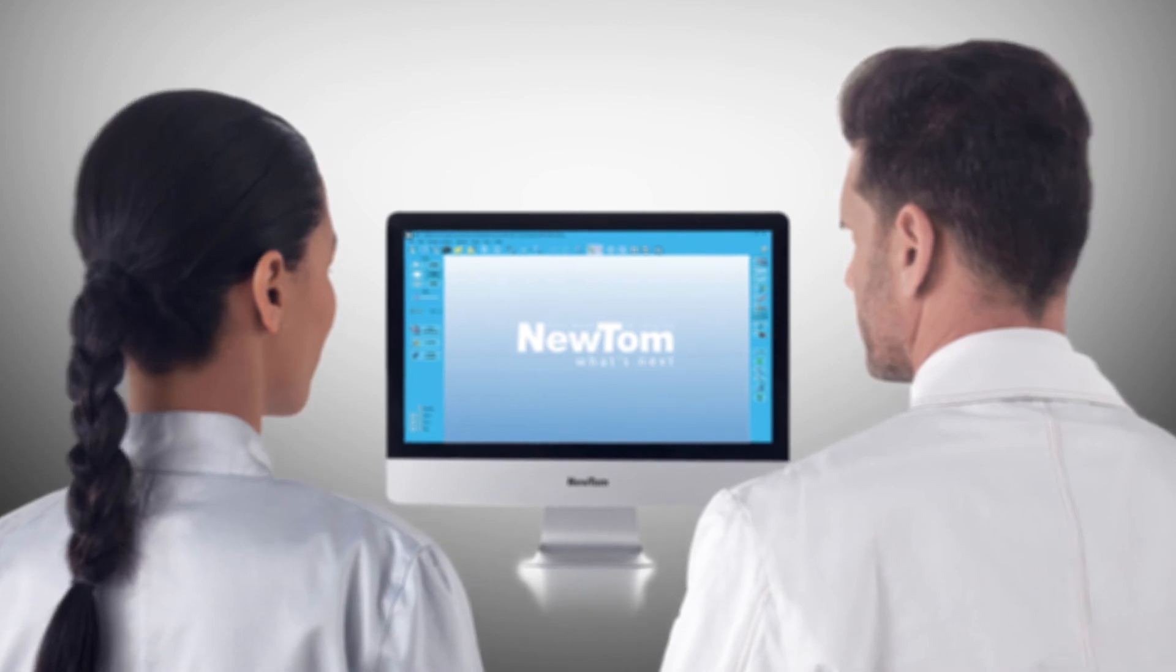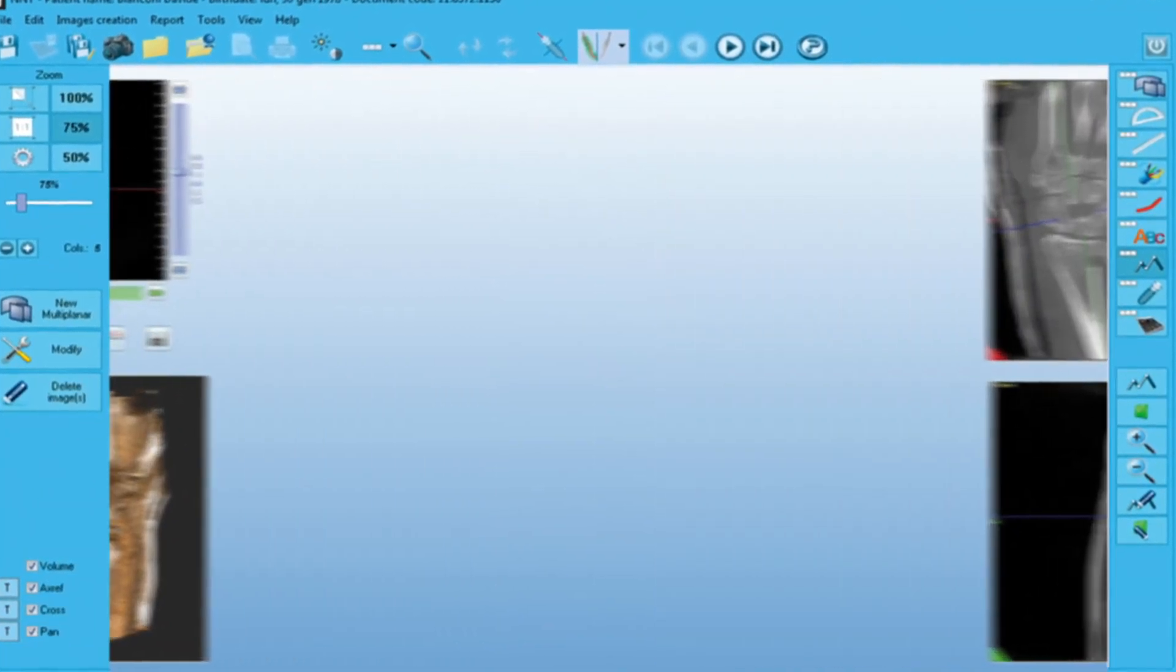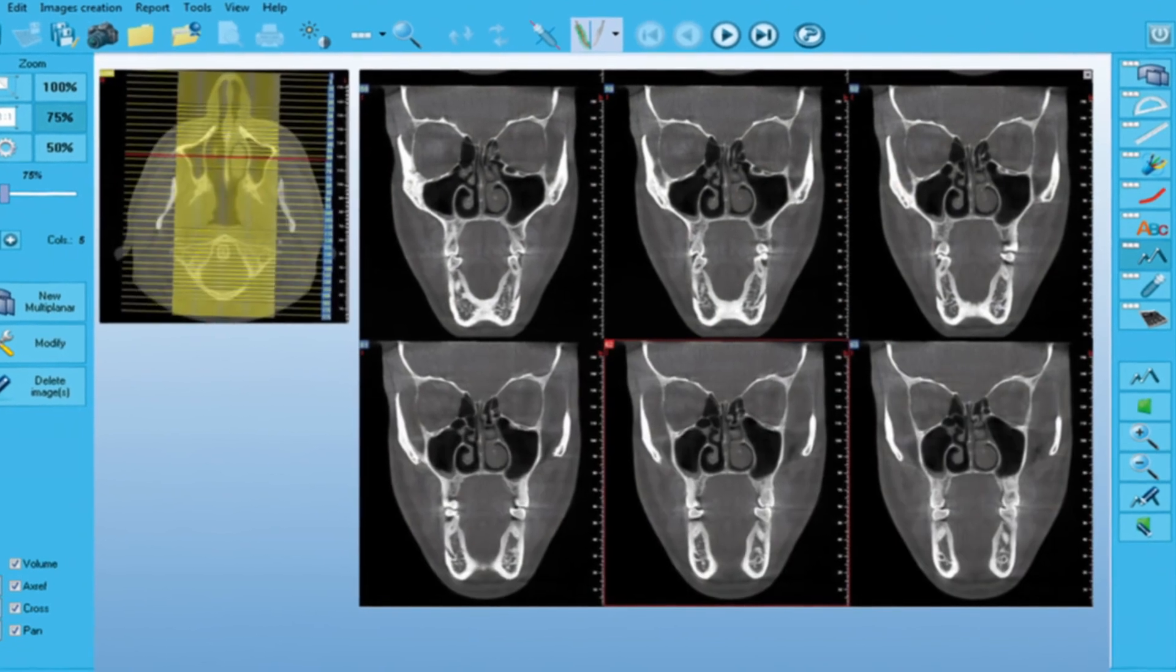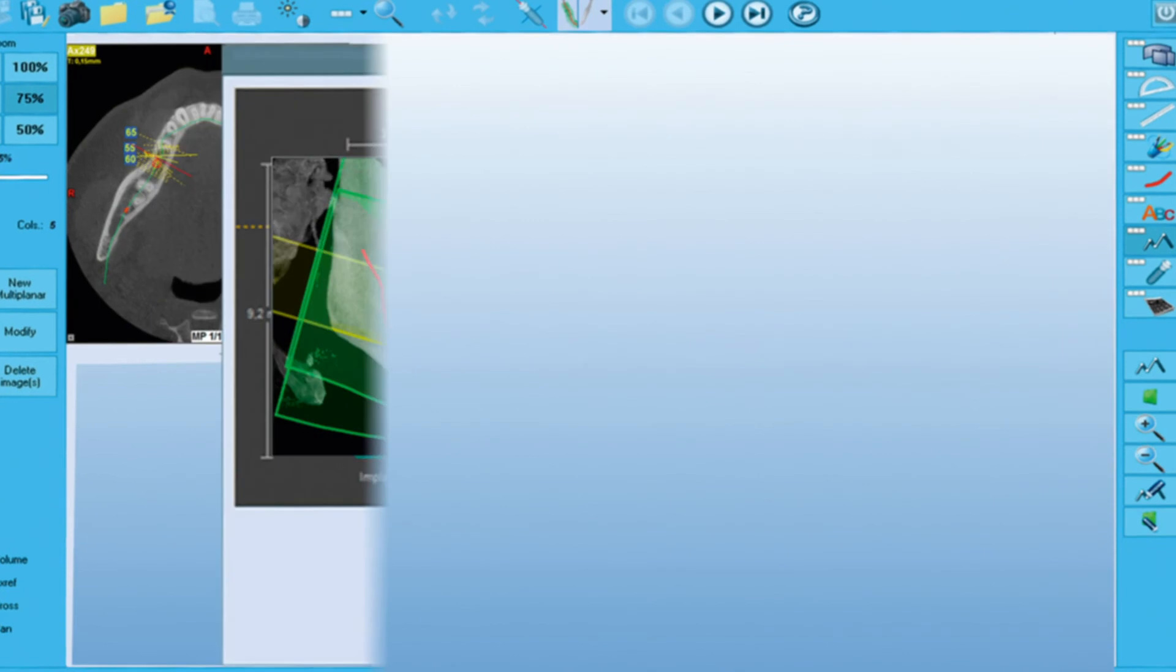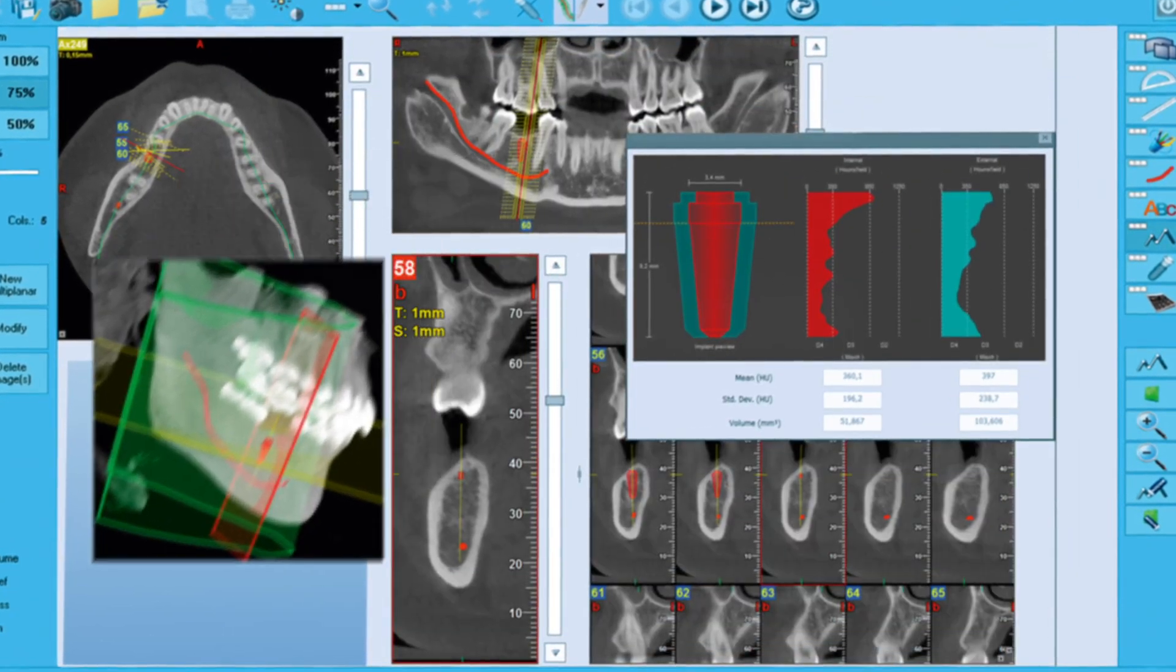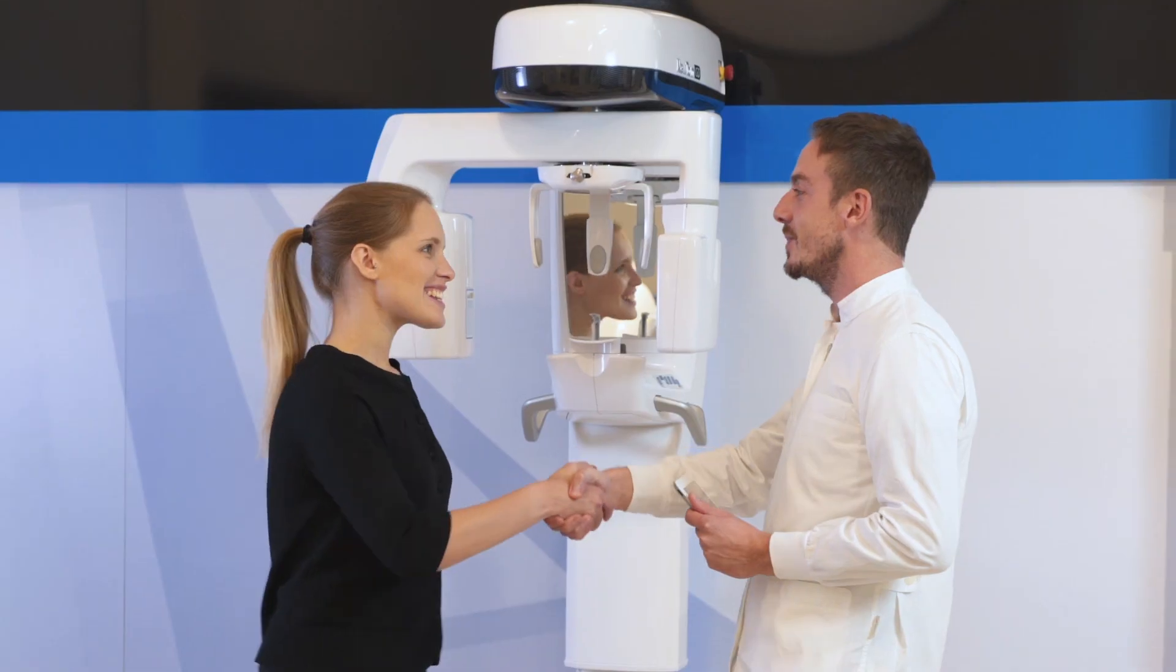Newtom is a pioneer of CBCT 3D technology applied to the dento-maxillofacial field. Thanks to its innovative technology and extremely high-performance software, Newtom Go is the best 2D 3D choice for even the most demanding professionals.